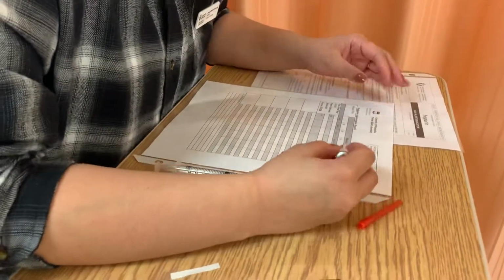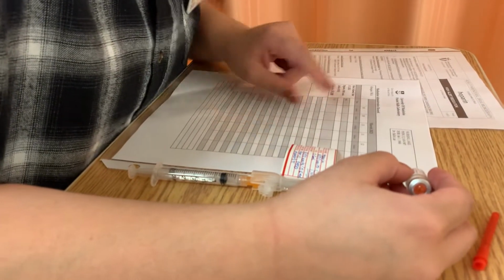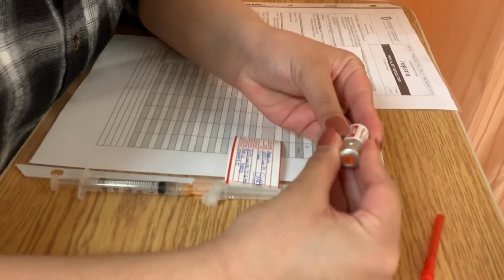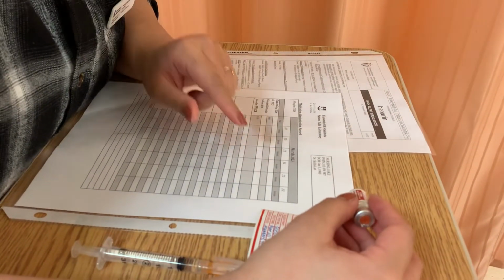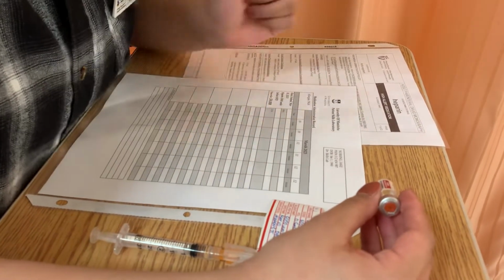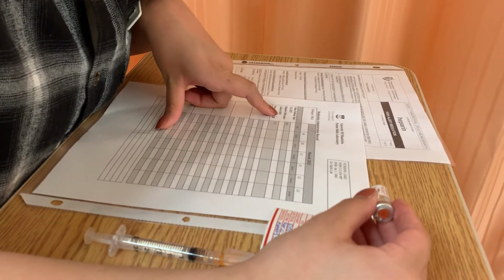So, right patient, Nursing Jake. Right medication is heparin. Right dose is 5,000 units. And I see here it's 0.5 ml because it says here 5,000 units per 0.5 ml. So I needed 0.5 ml. And on my syringe, I have 0.5 ml. And next is right route, subcutaneous. Yep, I have correct. I have the right syringe and needle size. Right time and frequency, twice a day.